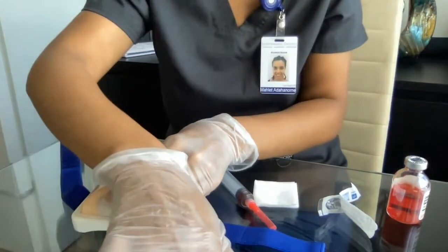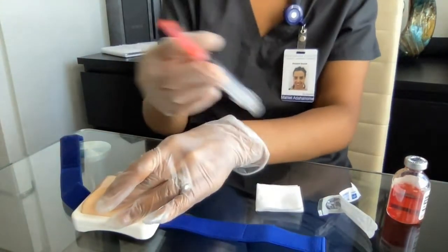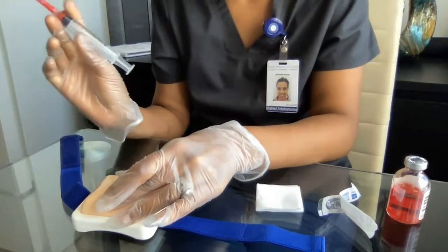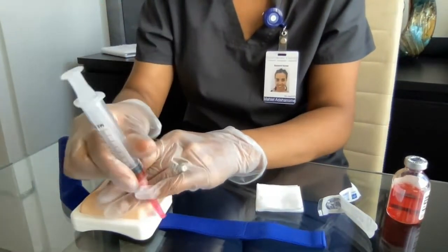I don't know if you can see it. I will let it dry. I'm not going to blow on it or anything.